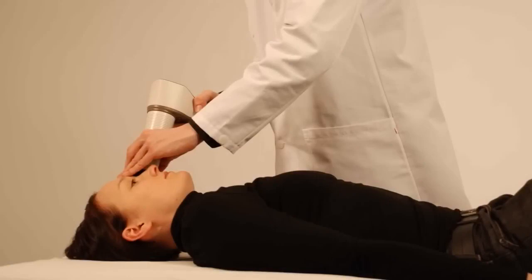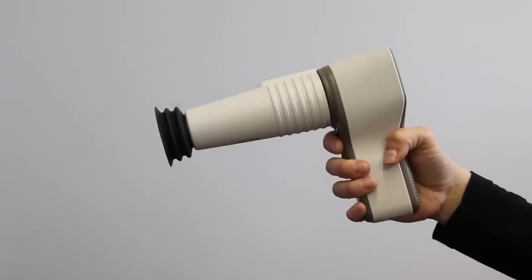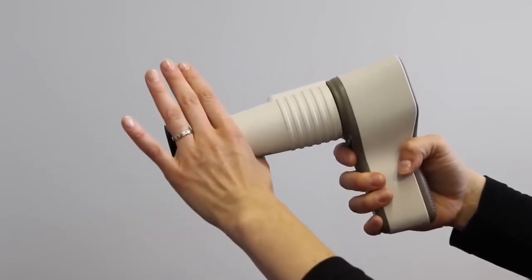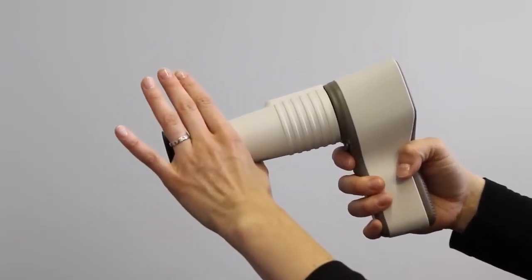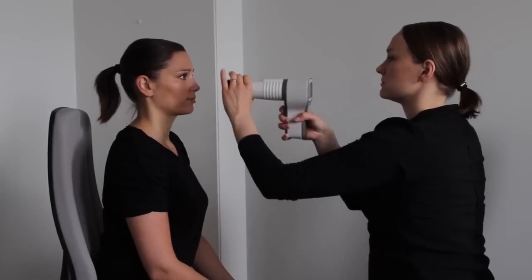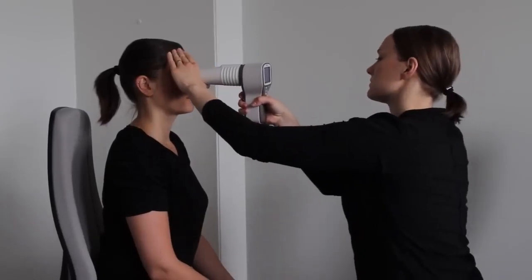Turn on the infrared aiming light by short pressing the left soft key or pressing the shutter button halfway down. Hold the camera with one hand and support the optics module with the other hand, keeping the outer side of the left hand against the patient's forehead.